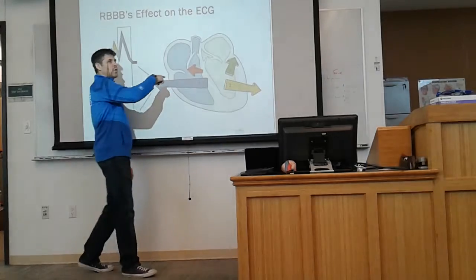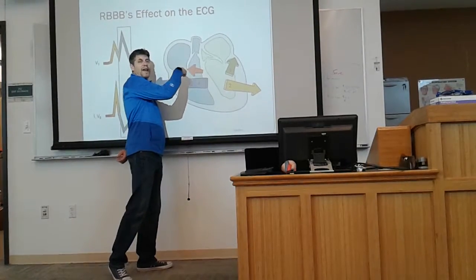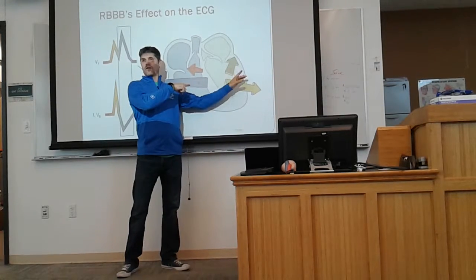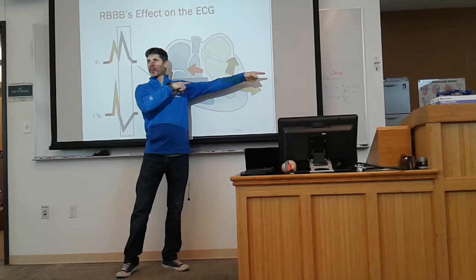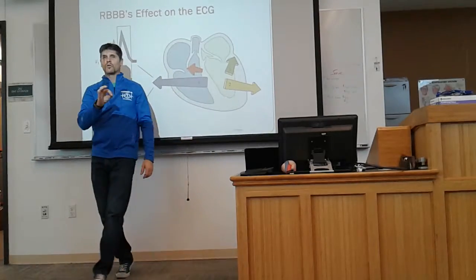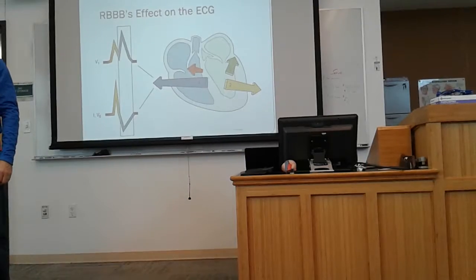If I've got V1, and V1 is here, looking at the right side, then isn't all of this stuff that's firing away from V1? So shouldn't V1 actually be negative, not positive? Do you understand her question now? Yes. And in fact, it is a lot.